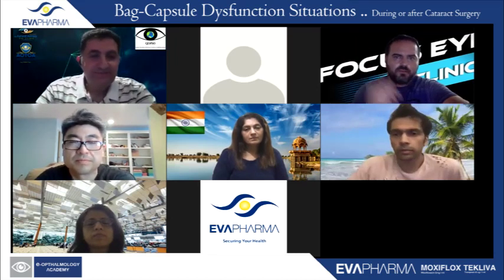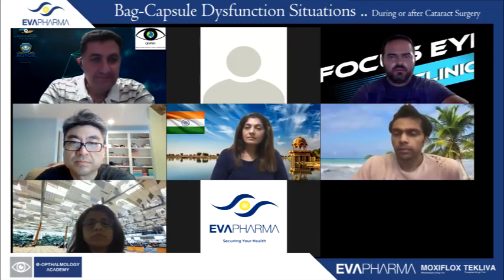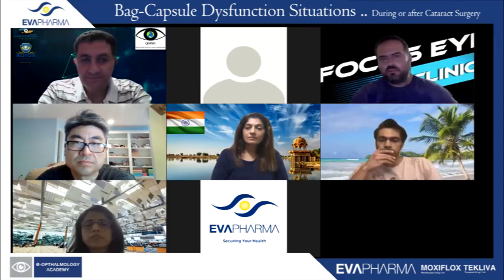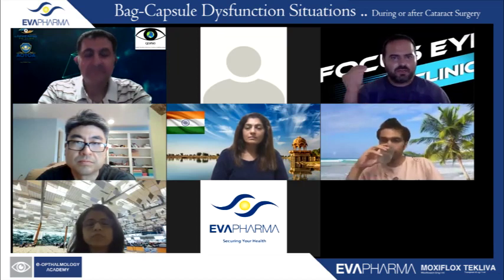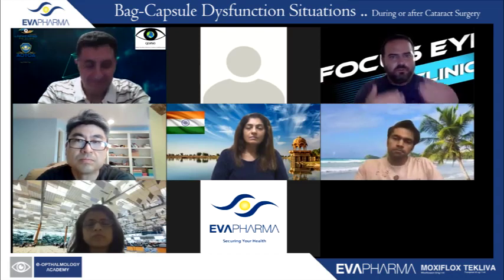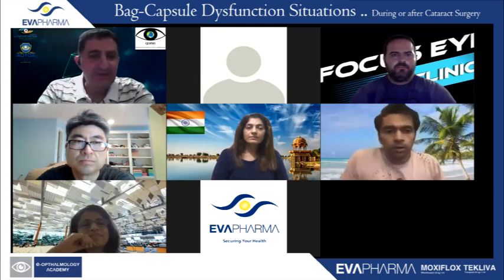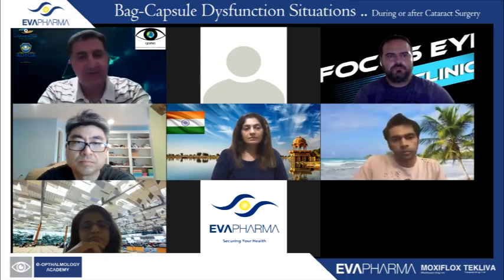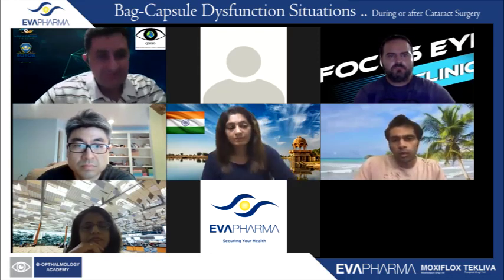Right. Thanks. Lukan? Yeah, Lukan. I want to comment on the second case. It was beautifully managed, and just a slight advice: you can continue to use the vitreous cutter to aspirate without changing to the aspirating handpiece. Just switch off the cutting and it will be easier, but it was perfectly done. Yes, this is true, Lukan. I sometimes use this technique to switch between the cutting and the aspiration, so as not to make too much manipulation inside the eye.